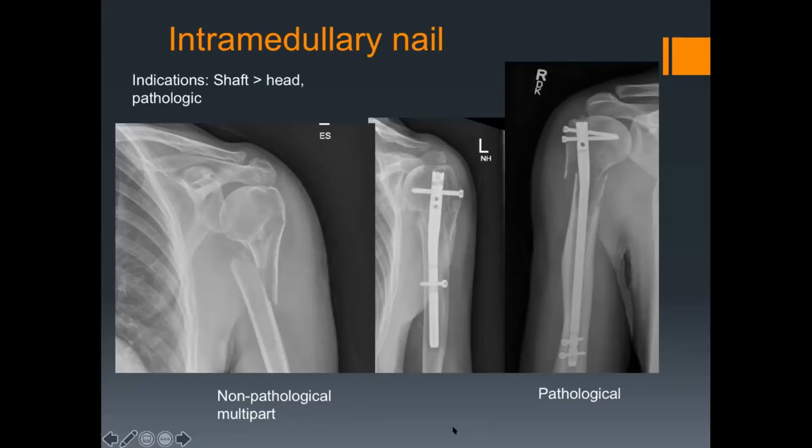And overall, the complications associated with nails are similar to those associated with plates. So things like screw cutout, non-union, and loosening. But I think overall, there's been a recent RCT showing that plate fixation has fewer complications overall in comparison when you look at the long-term outcomes. I don't know if that's right, Dylan, but for these fractures, I'm not sure in proximal humerus fractures.